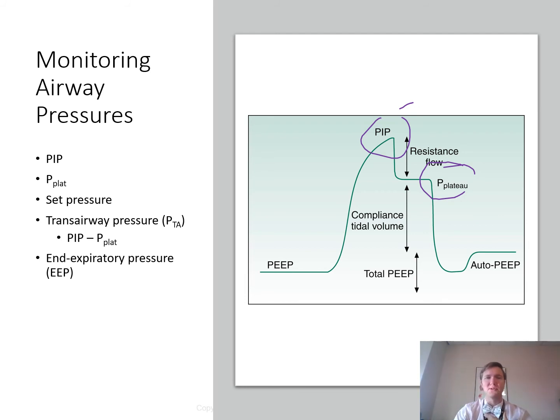There could be mucosal edema, bronchospasms, both, right, especially with pulmonary edema. It could be increased if the heat-moisture exchanger is partially occluded with moisture or secretions, right? So there's a lot of factors that go in here. So looking at the airway resistance and what could have caused it, it can be very important in making sure that you can take care of the patient in a timely manner.